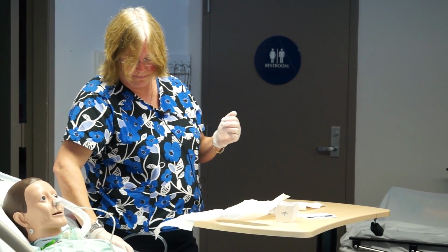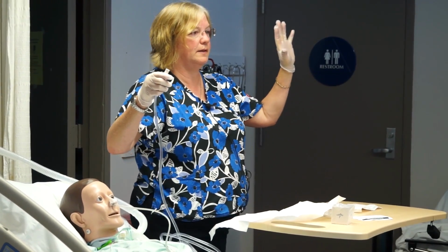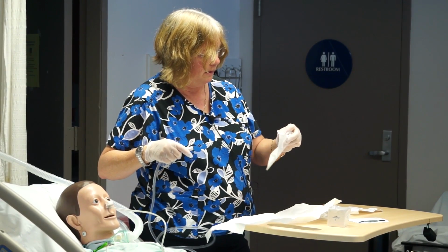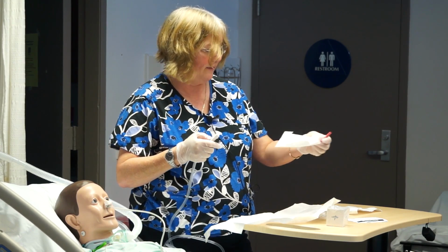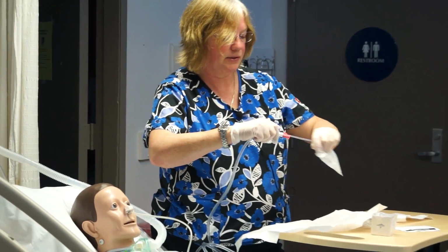That's a good amount. I'm left-handed, so my left hand is sterile. This one's not sterile any longer. Before I touched this, I could have navigated this little pink part out here. I'm going to attach that to my suction.